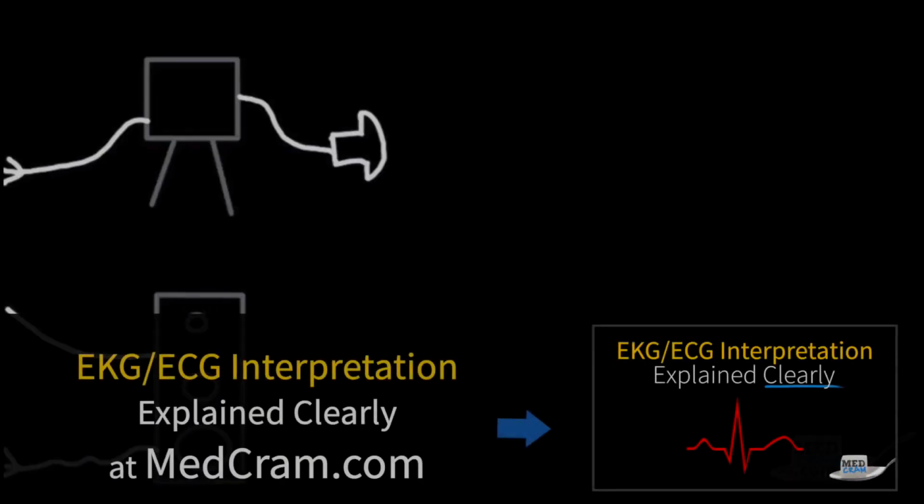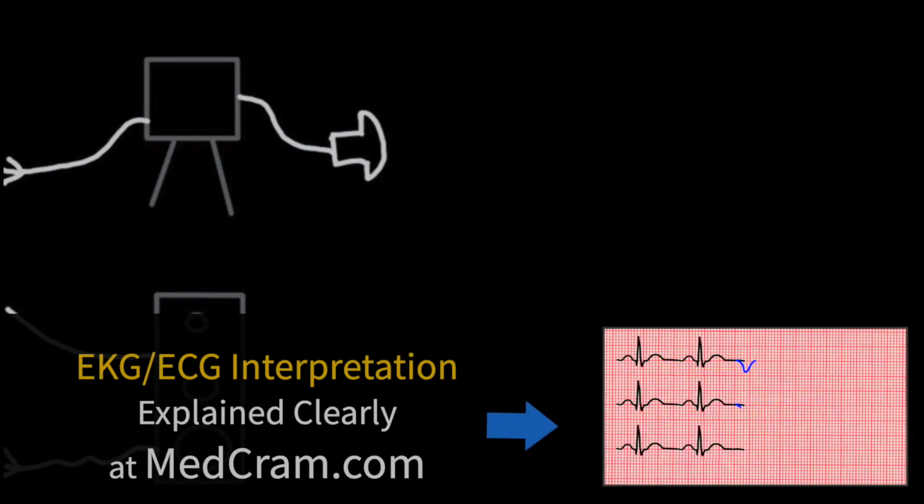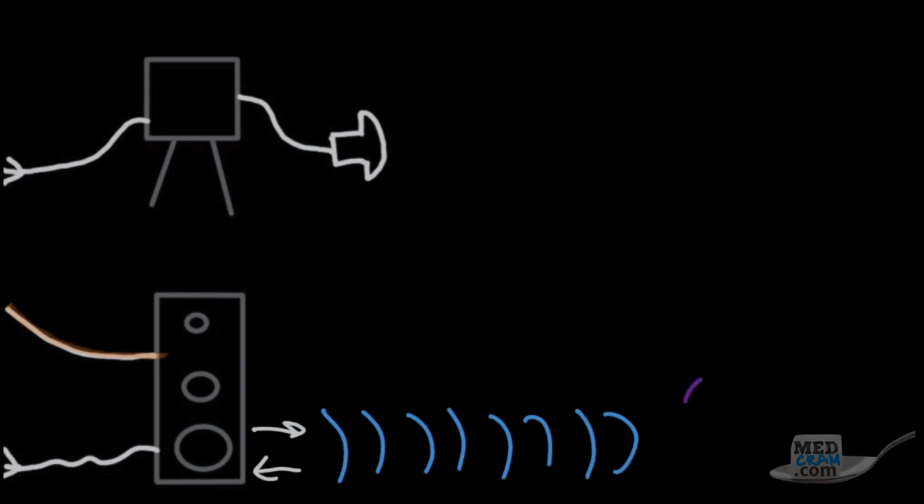Before we dive into ultrasound physics, I want to briefly explain how an ultrasound machine works. And while you may not be familiar with an ultrasound machine, you're likely familiar with the speaker. Since they both generate sound waves, it provides a good example. The speaker uses electrical energy, and the electrical waves that travel through the speaker cable cause the speaker to pump in and out. This generates sound waves in the air, which are then heard by the human ear.